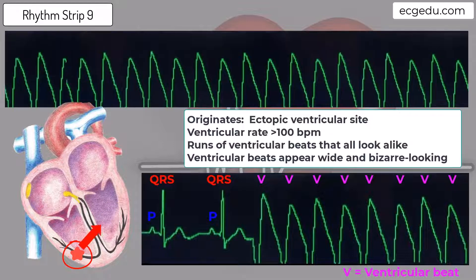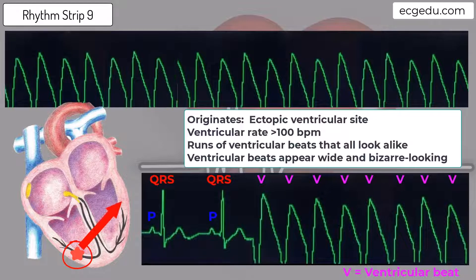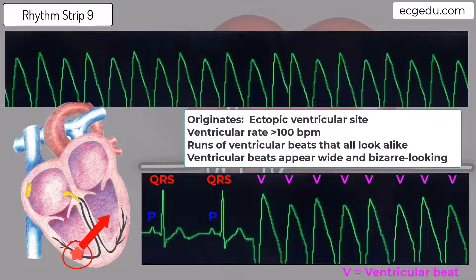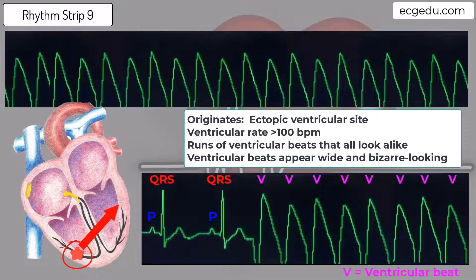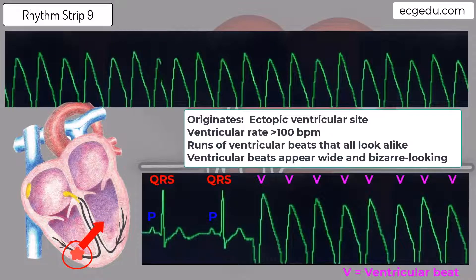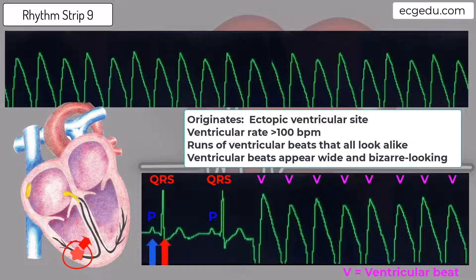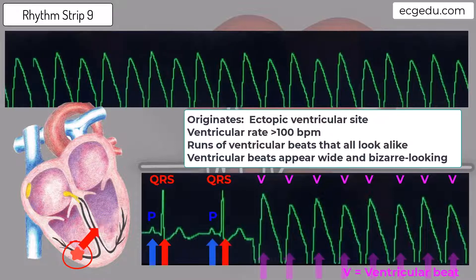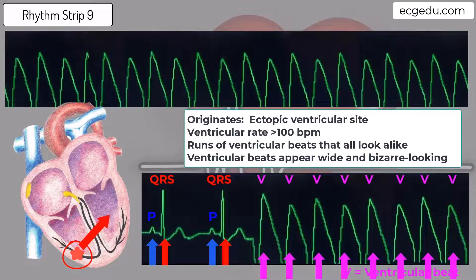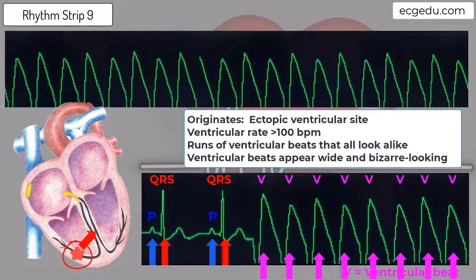Runs of ventricular tachycardia lasting less than 30 seconds are called non-sustained. Runs lasting more than 30 seconds are called sustained. In this example, you see a sinus beat — PQRS — followed by another sinus beat — PQRS — followed by multiple premature ventricular beats in a row.